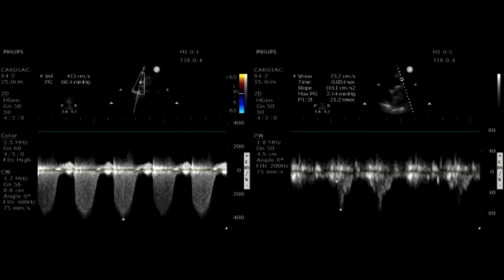In patients with marked pulmonary hypertension, there's a much more rapid peak of pulmonary arterial pressure because the pulmonary circulation is non-compliant. And you will see that there's a temporary cessation of flow from the right ventricle to the PA when the pressures equalize, and the wave that is a propagation that goes forward from the right ventricle to the PA is already reflecting back because either the circulation is non-compliant or there's an obstruction to the circulation, as occurs in the case of a PE.